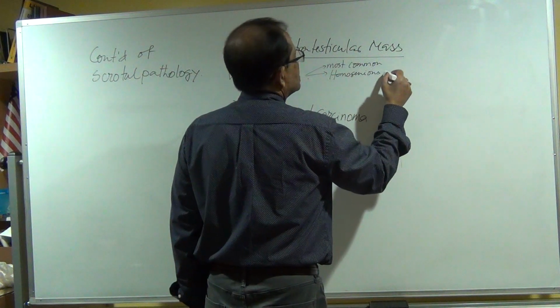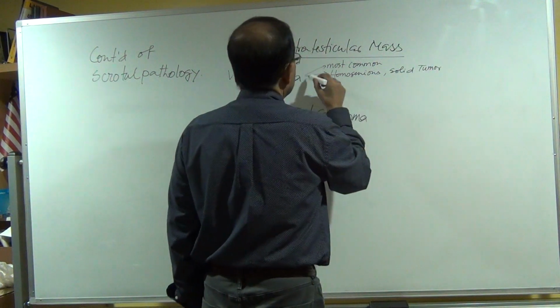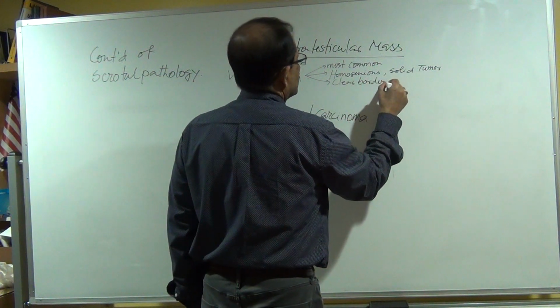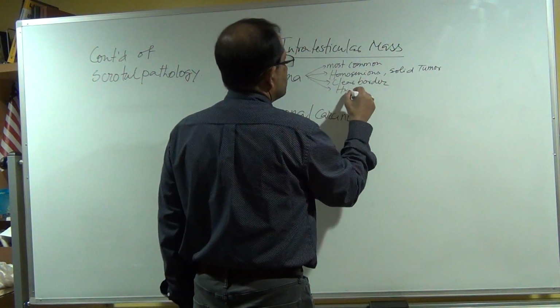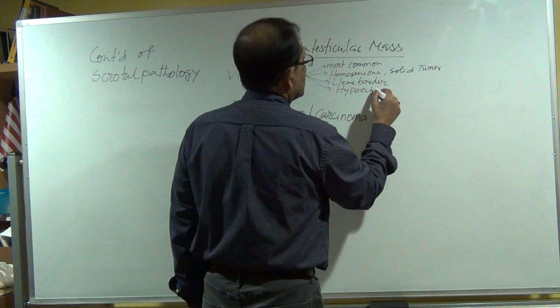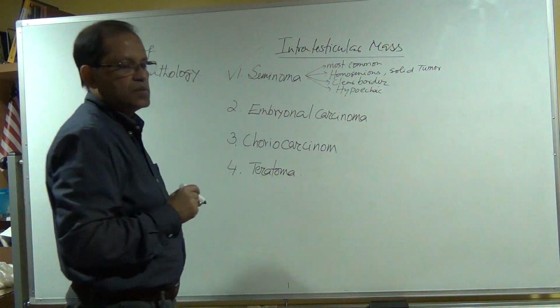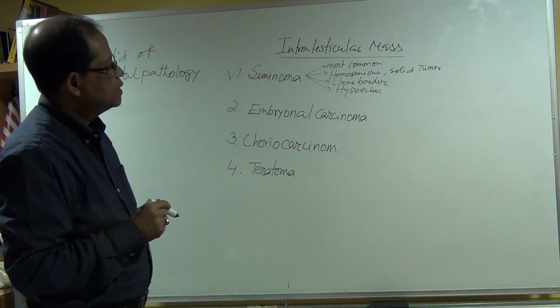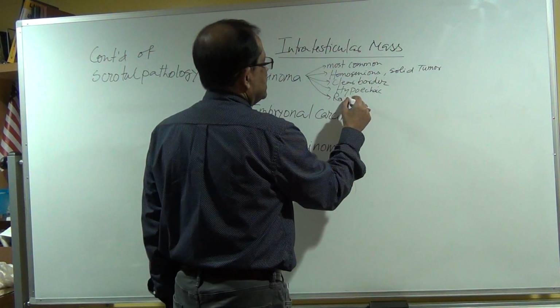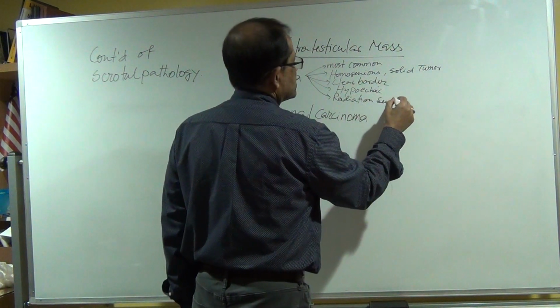Homogeneous solid tumor, clear border, hypoechoic, okay, and radiation sensitive.